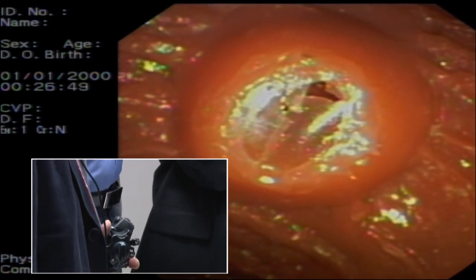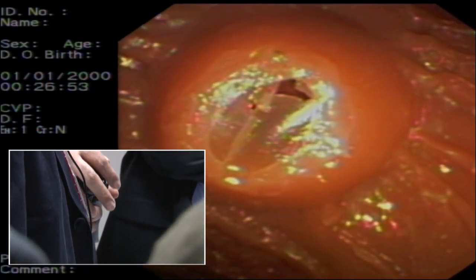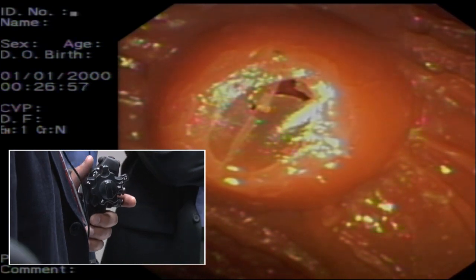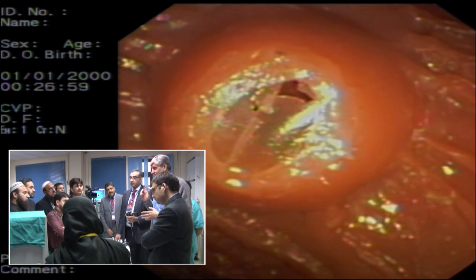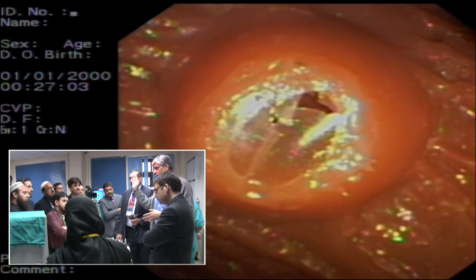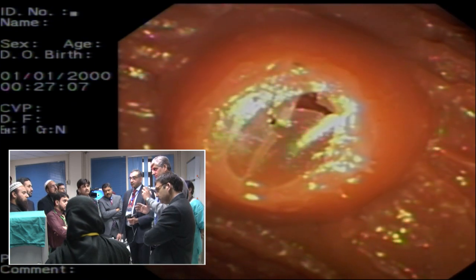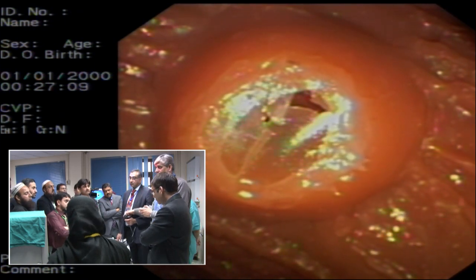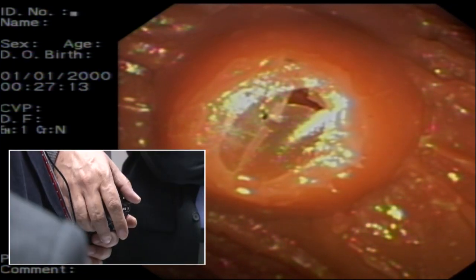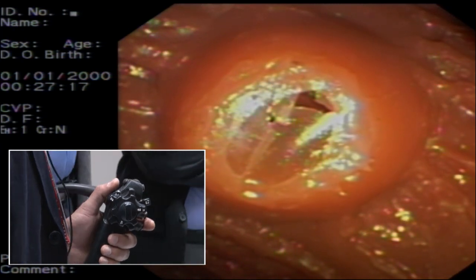If you're working in a place which has 1 or 2 scopes, one of the things that is very important is not to put too much pressure on your arms, especially the elevator. You have a difficult stricture you can't get through. I think if you have a single scope, you put in a 7 French stent and ask them to go to another center. You've done your job. Okay? But if you try and use too much elevator and too much of these pressures, you're going to break something, most likely the elevator will go. Elevator goes, you stop functioning. So you have to choose.